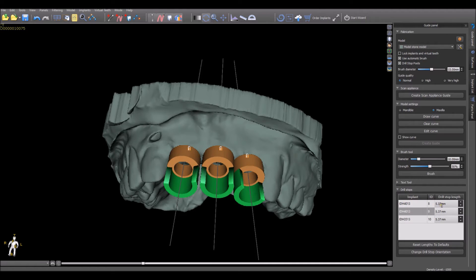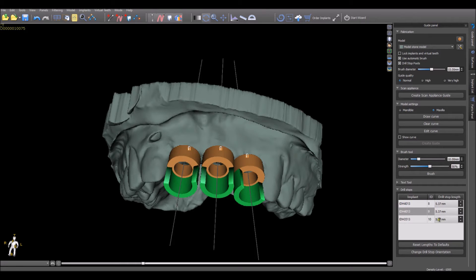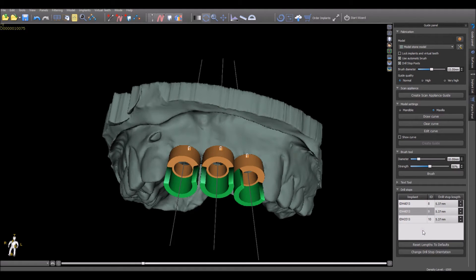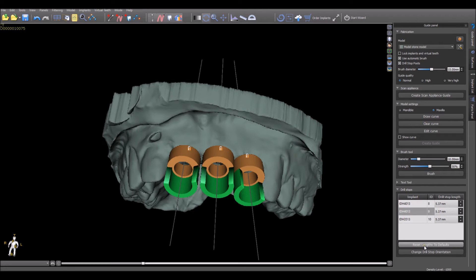If we want to override any default lengths for the built-in drill stops, it can be changed manually in the box below. This will override any default settings or calculations done by the software. If the changes are made and the user would like to reset the lengths to default, simply press Reset Lengths to Default.